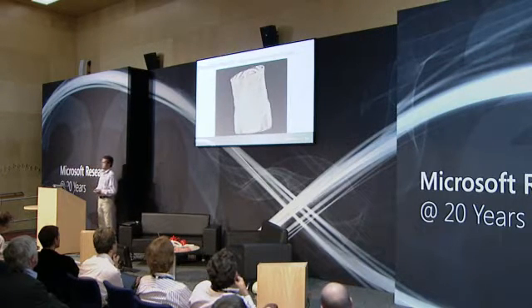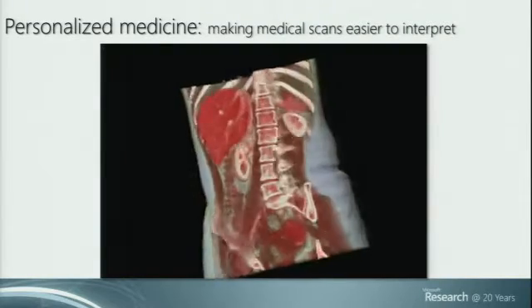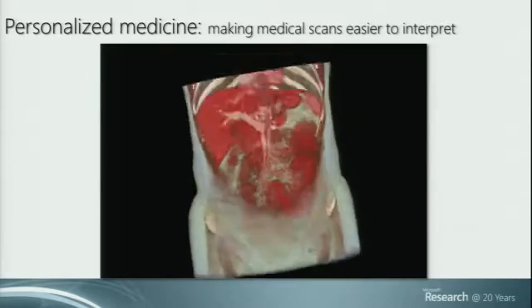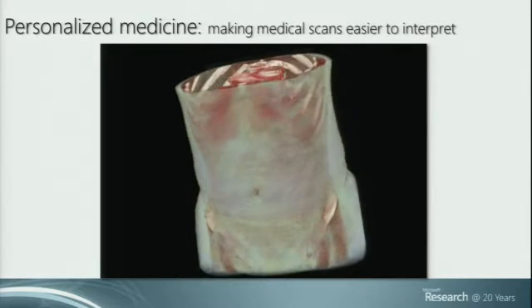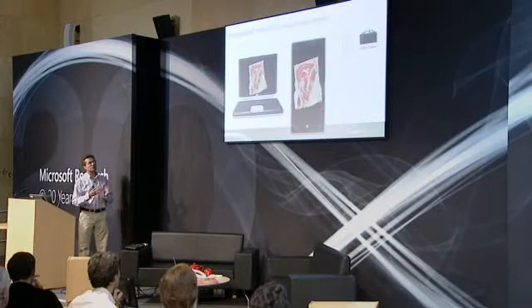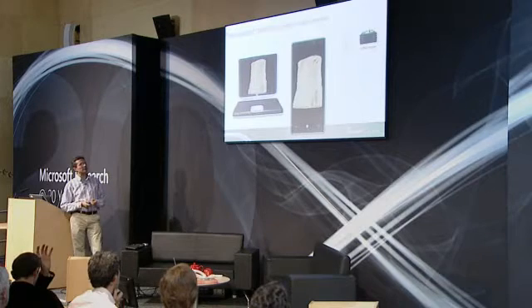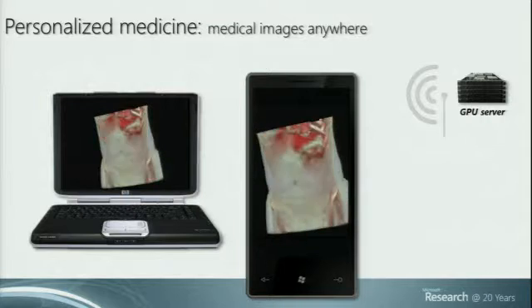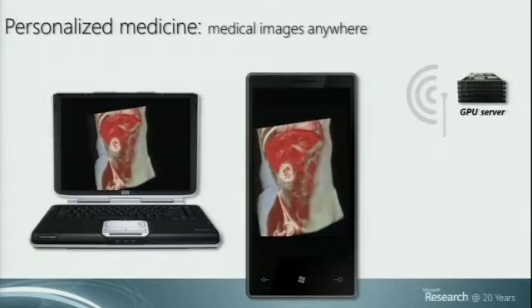Well, in terms of educating the patient, we can do something like visualizing images in a colorful 3D rendering sort of way, which is nothing particularly new. But what we have done in this team is making this sort of visualization, which is a lot easier for all of us to interpret, available very cheaply. So cheaply that, in fact, this sort of rendering technique can be run off your laptop without using much computational power, or your telephone. And why is that? Because we have come up with a simple way of doing all the computation that is necessary for this 3D rendering on a GPU server farm. And then all the image data, once it's rendered, once it's generated, can be transferred to any lightweight device. So this is the first sort of graphics-like innovation.